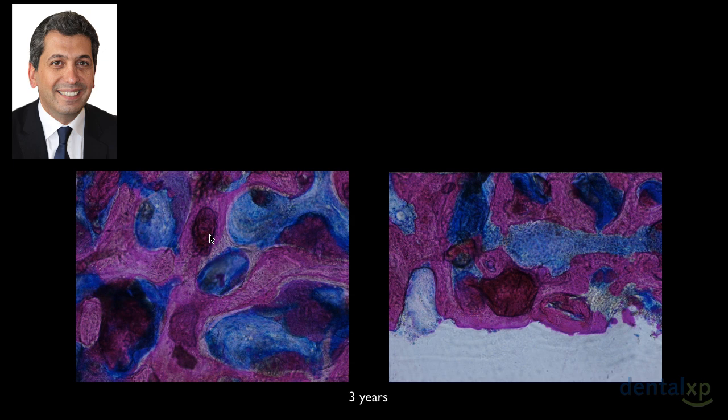They are still there, but you can also see that they are totally engulfed with new bone formation, and we have a lot of new bone formation, which means that this biomaterial could achieve volume stability. It is resorbing, but at a slow rate, and it is osteoconductive, allowing for new bone formation inside the sinus. And this is the type of biomaterial that I usually need to have whenever I am coming back to place my implant into a sinus.